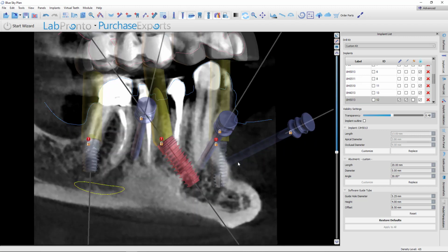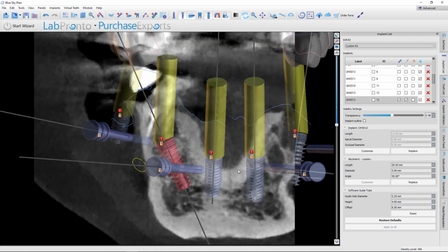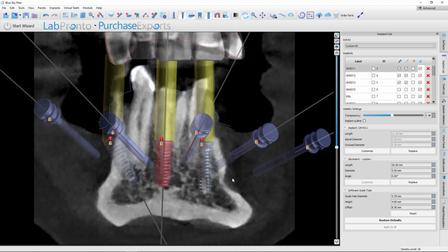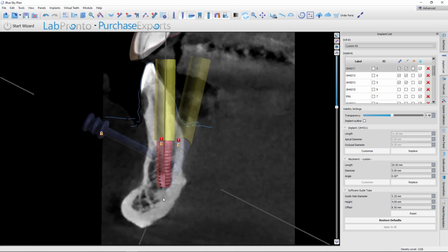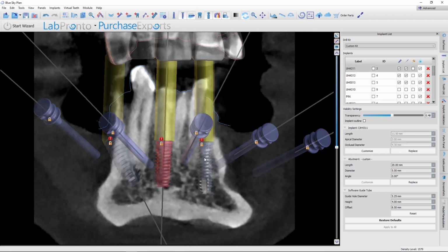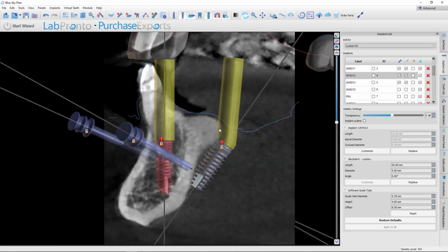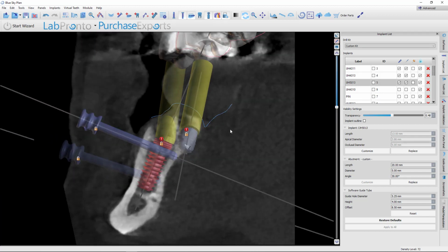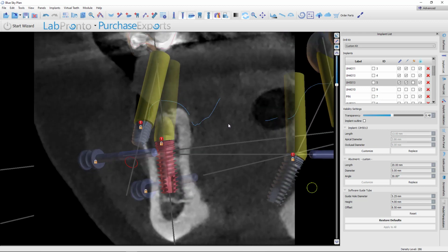This is the disto-angled one. So you can see we're fairly close proximity to that mental foramen. And 30-degree angled multi is going to upright this. In the anterior, we've got straight up and down implants. I could go a little longer, but then I'm going to be drilling into this cortical bone. That's going to make for a lot tougher drilling, and that really ought to be plenty of implant. That's a 4.3 by 11. This one we got 4.3 by 13. So lots of titanium in here. This should be plenty of implants to be able to get an immediate load restoration on. These distal angled ones, you really got to be careful to look at them from all angles.